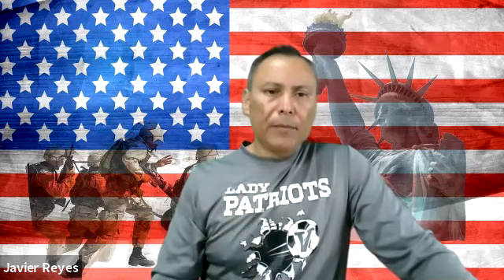So you hold these tubes in an upright position. Again, remember that. This allows the blood to go back. So when you bring them back into the laboratory, the technologist will remove the stopper, the little cap on it, and it minimizes the amount of aerosols that are going to spray. But that's what they do once you bring them in. Non-anticoagulant tubes, gel tubes, should be placed in an upright position as soon as they are mixed.